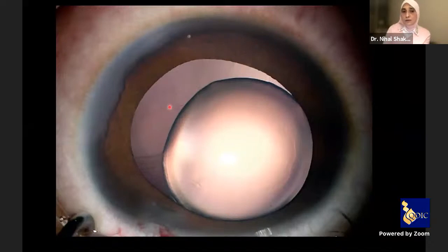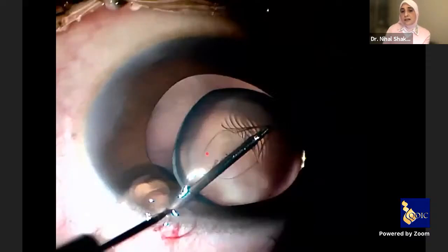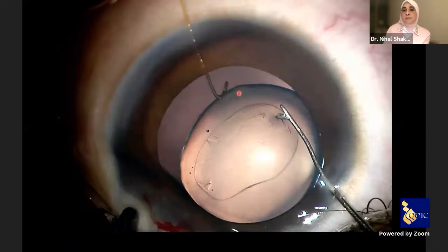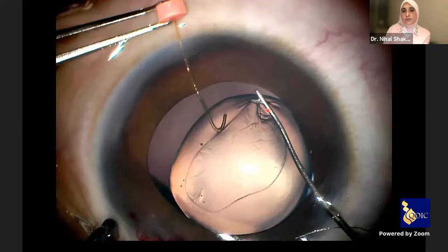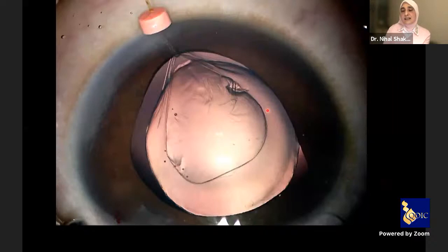Even without full zonular attachment — there is only peripheral zonular attachment — and there is a long-standing peripheral anterior synechia from three to six o'clock position. In these cases, how can you perform anterior rhexis? With the micro rhexis forceps, you push in a direction parallel to the subluxation — push, push, push — and then complete in the conventional way. With a Y-shaped cannula, you push the rhexis towards the hook to facilitate hooking of the anterior rhexis, then complete the surgery.